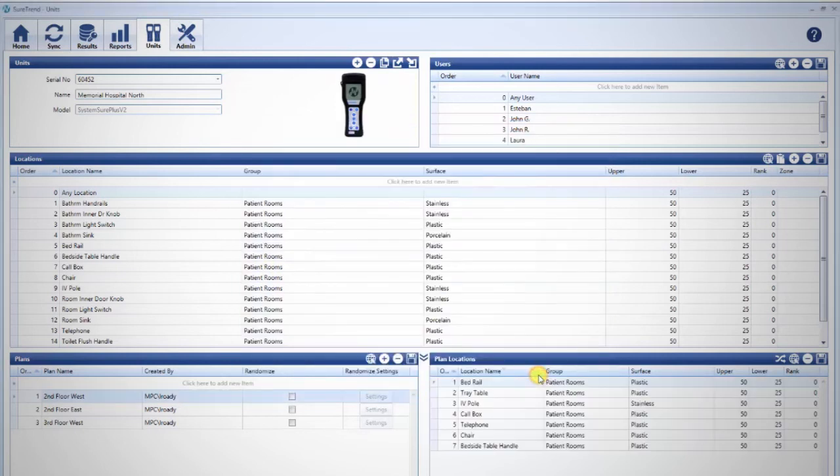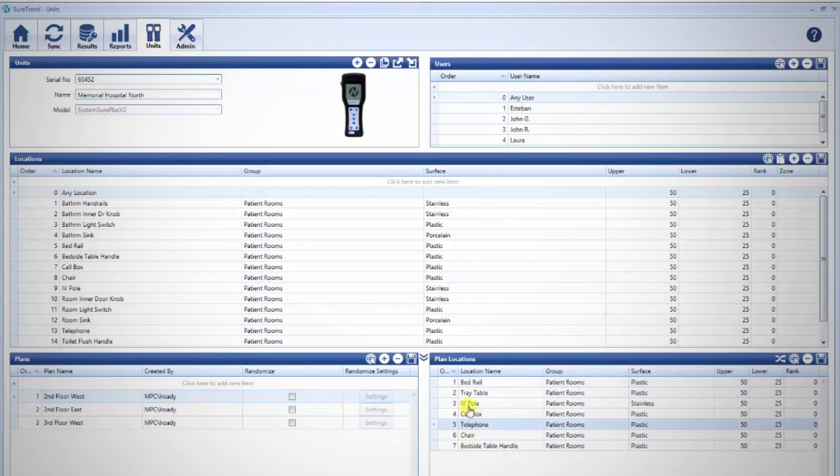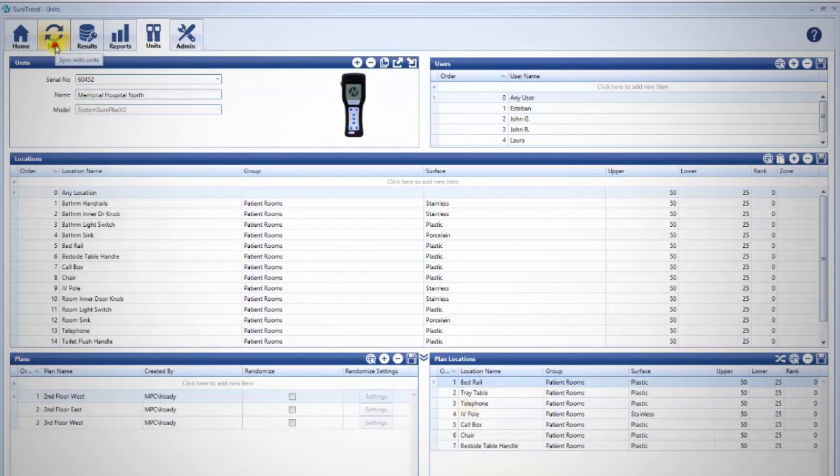Now you may rearrange the order in which the locations will appear in the plan by clicking, holding, and dragging rows to the desired position. Remember to sync your unit when you're done.